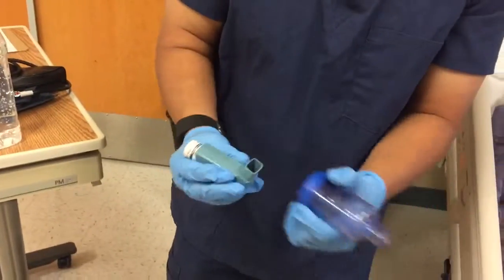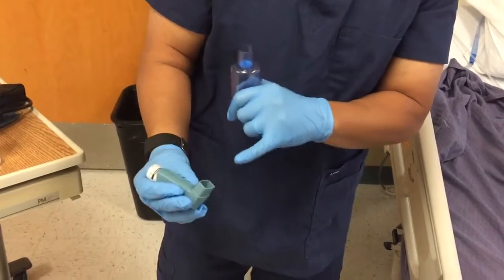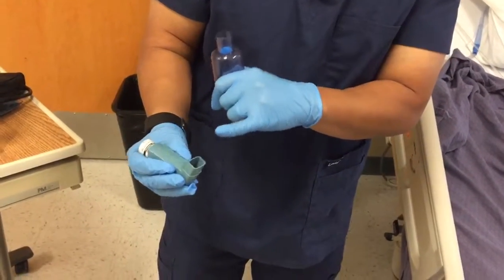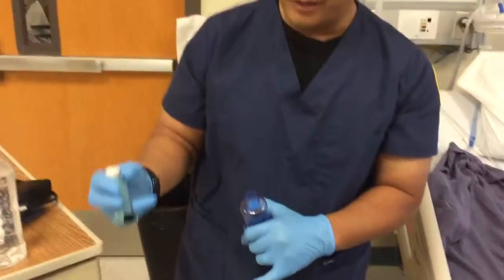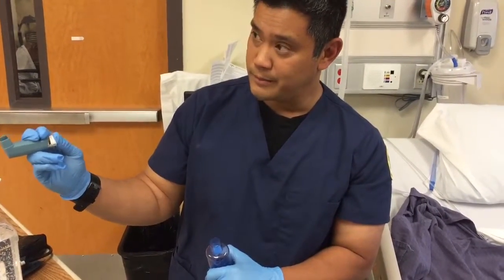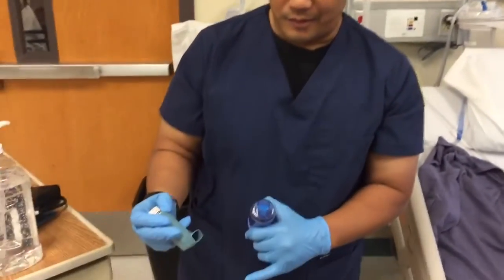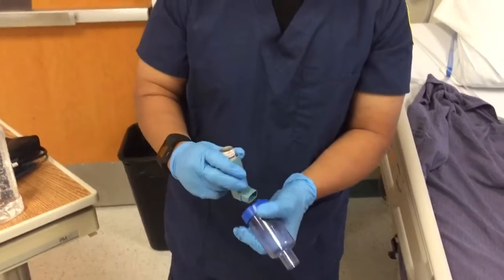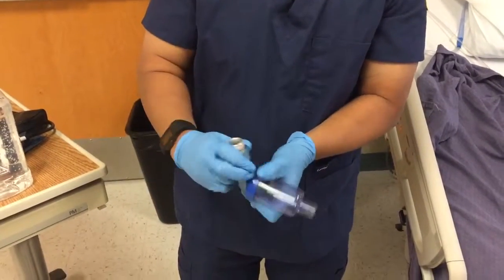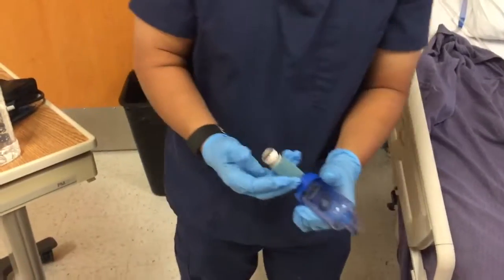Sorry, also one thing we need to do is prime it. If it's brand new, or has been sitting around for a while, there could be dust that has built up, so it does need to be actuated or primed. You probably want to do it twice, up in the air, away from yourself, and that clears out debris in the device. Afterwards, insert it inside the holding chamber, and you can actuate the device.